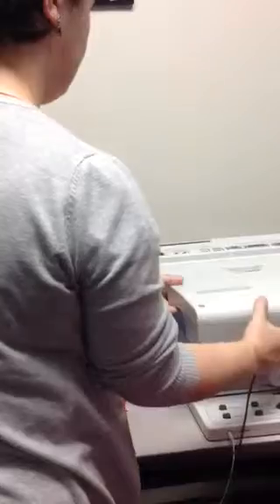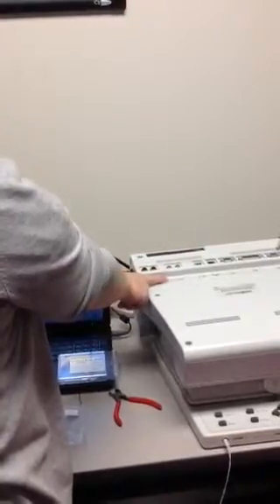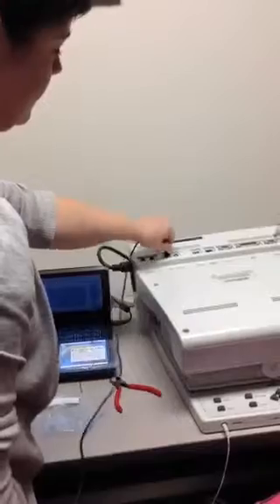Okay, so on the back of the VeriFit, just tilt this forward, you will see on the back, there's a man's head. He has a speaker in front and a speaker behind his head. You're going to plug this into the port representing the speaker behind his head.